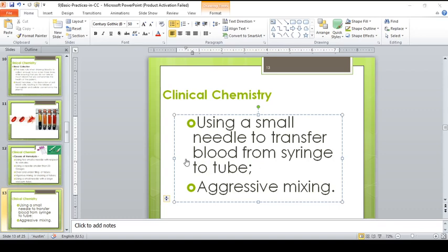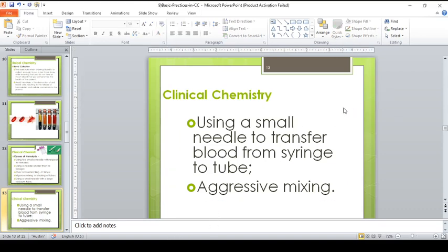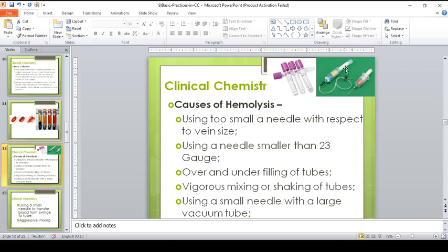I know it's really hard for you to imagine this yet, but I hope you can still get it. Like for example, in the collection process, you use a syringe, and then you put the sample into an evacuated tube.